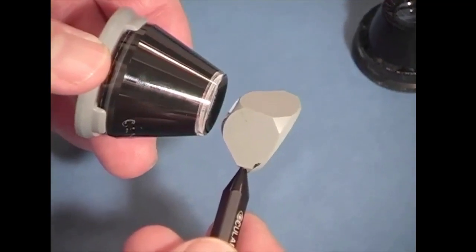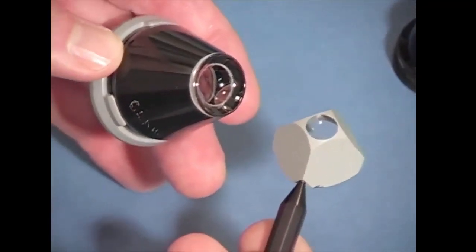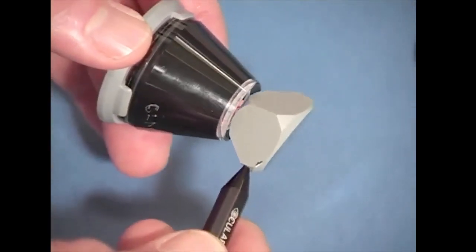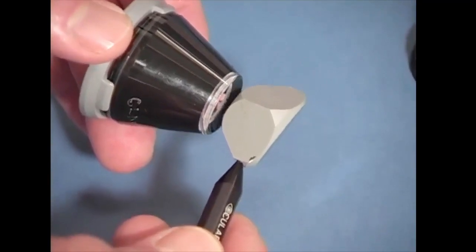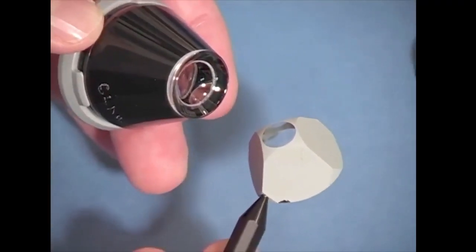You see that the area of contact is much, much smaller than with a 3-mirror Goldmann style lens. And that's why this lens works so well for indentation and the bigger lenses don't. It also is one of the reasons that you don't really need to have a coupling solution.